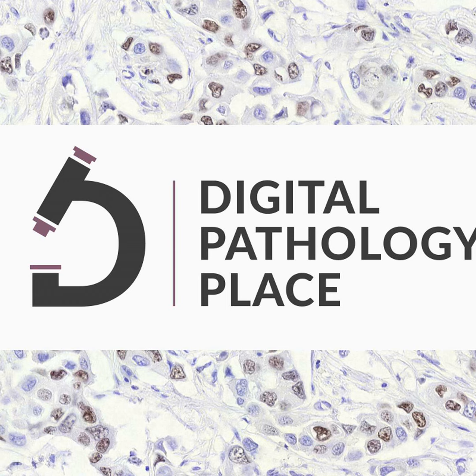These transformer models, this transformer architecture that came out in 2017, ends up being very compute hungry. So it's expensive. And in digital pathology, the images are very high resolution. If you want to have many images, so you've got lots of slices and they're all high resolution, it's just computationally too expensive to be able to do right now. There's a quadratic equation that's associated with the cost for transformers. So we're going to need to transform again.